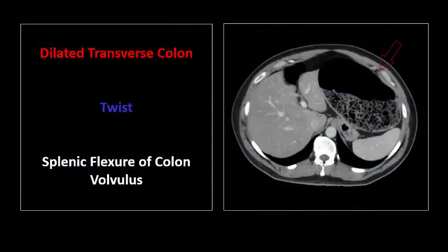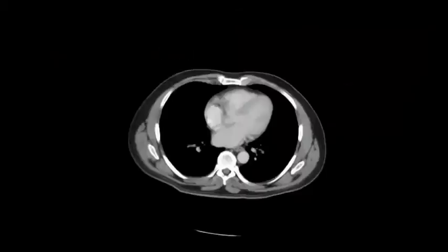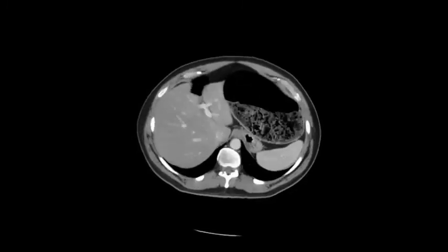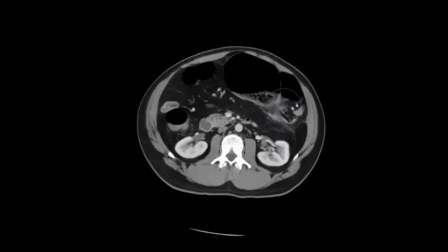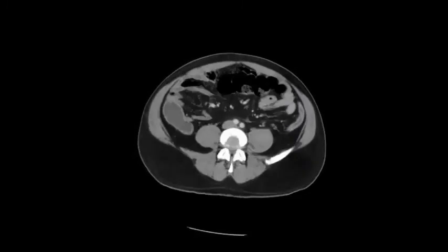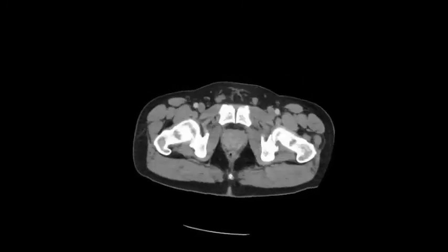Moving on to the splenic flexure. Again we see the dilated transverse colon, and the twist of the mesentery now in the left upper quadrant, compatible with splenic flexure volvulus. The axial series again shows the dilated transverse colon with a swirling pattern in the left upper quadrant, compatible with large bowel obstruction secondary to splenic flexure volvulus.